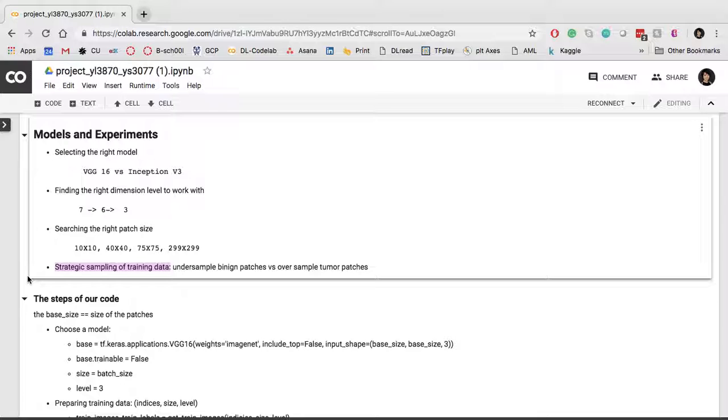However, the prediction performance was simply heartbroken. We suspected that 15 images probably were not enough for the model to learn. So we then designed an oversampling method which randomly samples from the cancerous patch pool until we reached the target ratio. We kept all the non-cancerous patches. This drastically increased our prediction accuracy and allowed us to predict with consistency and high precision.